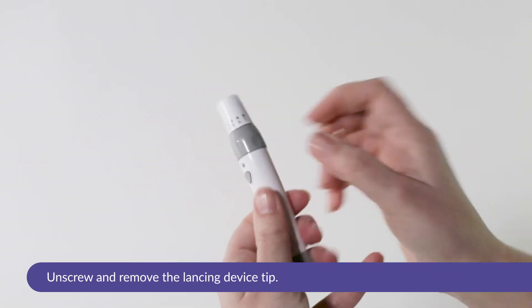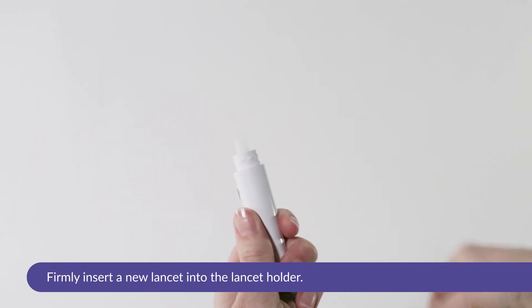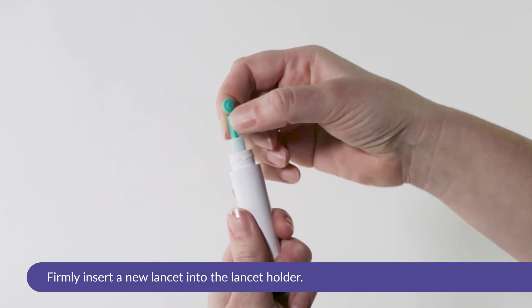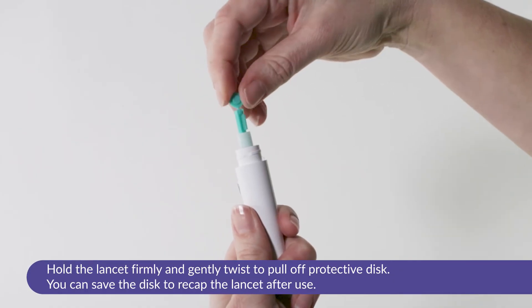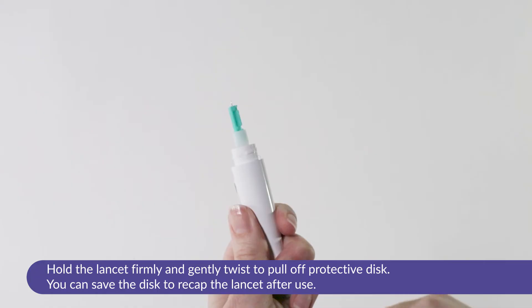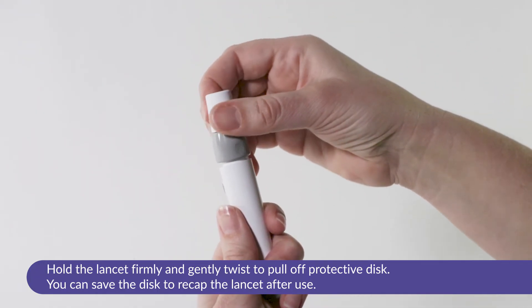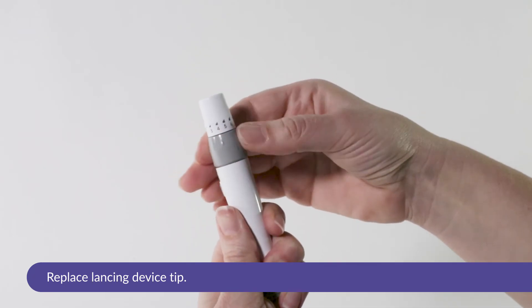Unscrew and remove the lancing device tip. Firmly insert a new lancet into the lancet holder. Hold the lancet firmly and gently twist to pull off the protective disc. You can save the disc to recap the lancet after use. Replace the lancing device tip.